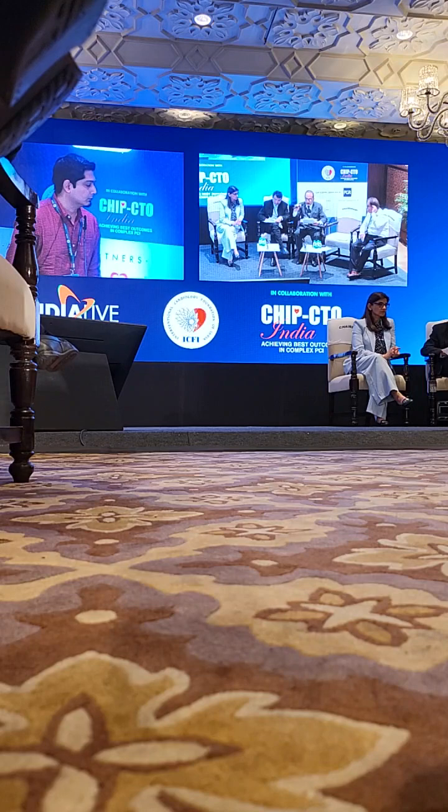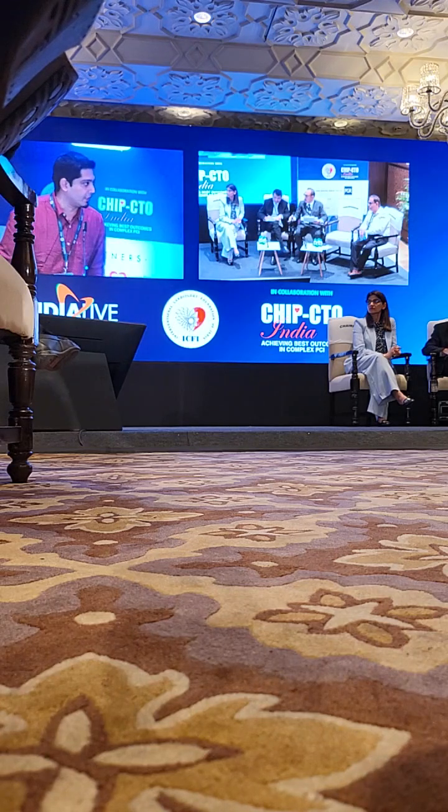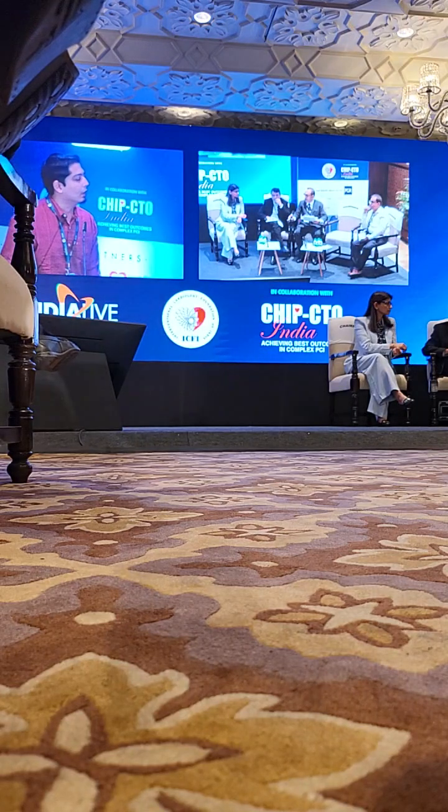Ultimately, what do you think was the reason for your catastrophe? Trying to pass a 3.5 stent in an LAD that probably could not take a 3.5 stent. That started everything. Then spiral dissection, then diagonal loss, hypotension, and then from there, a couple of panic moves from our team also did not help at all.